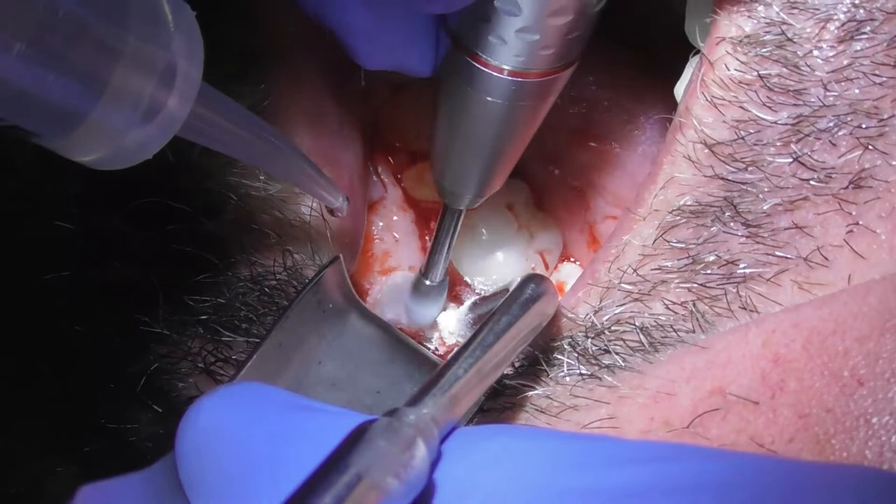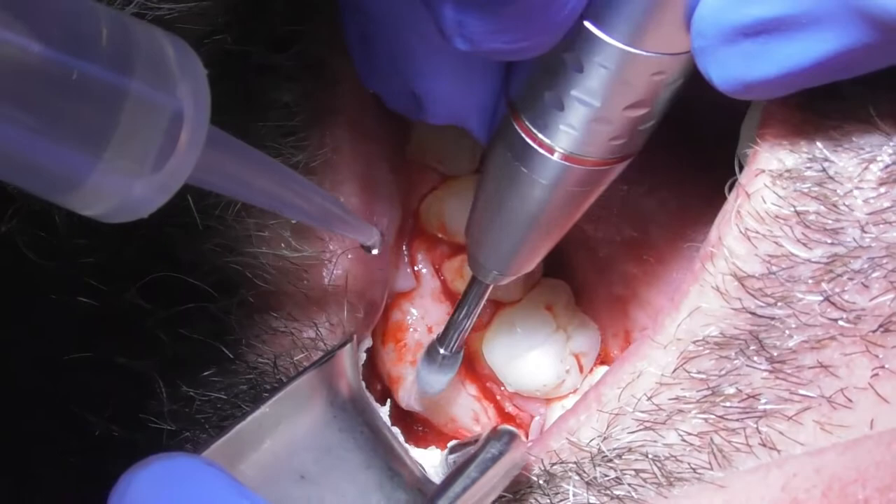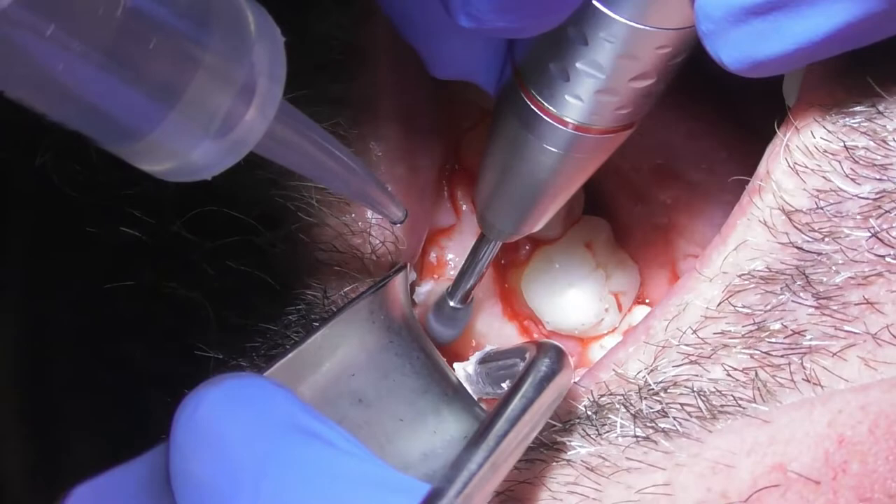Doing very well — a little more water. Right on the cutting edge of the burr. I'd say we've got about a third of it gone. Just squirt right on that burr, right on the working end.